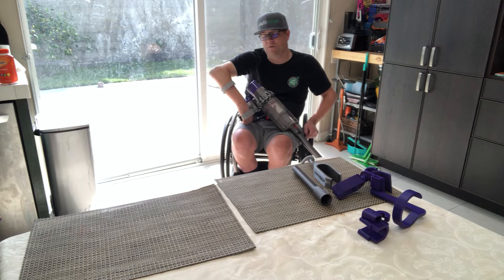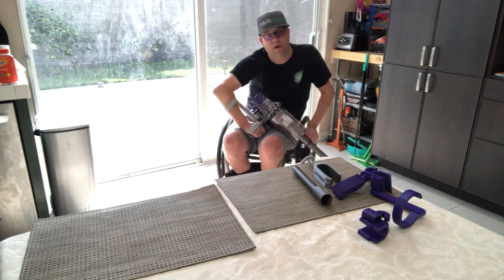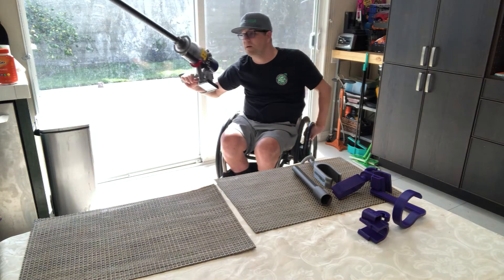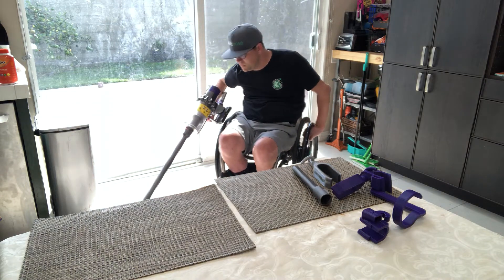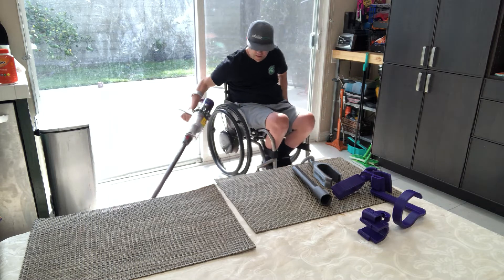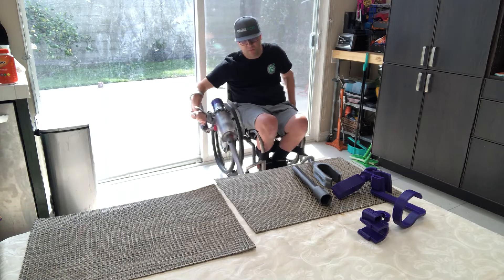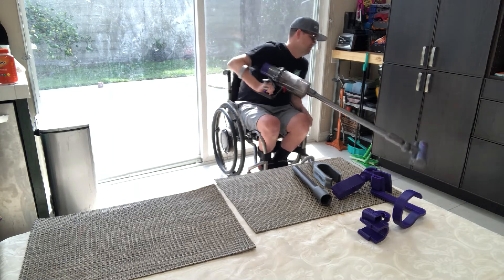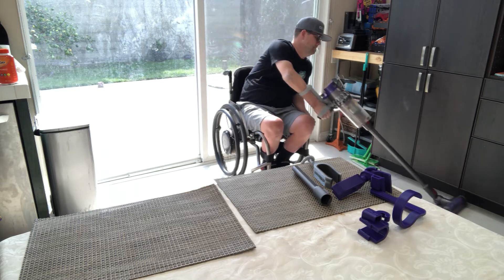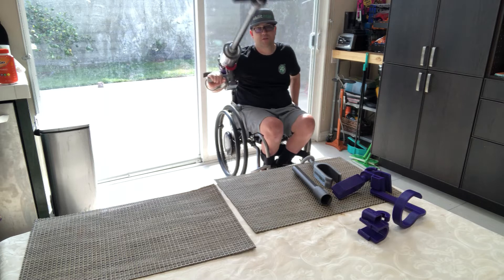I have power assist wheels which makes this easier to manage, and keep in mind I'm left-handed but I'm showing you with this right-handed model. I put my arm through, put my hand in the cuff, and you can see when I turn it, it engages. I can lift it, switch sides, start with the left and switch to the right, and move my chair with it.